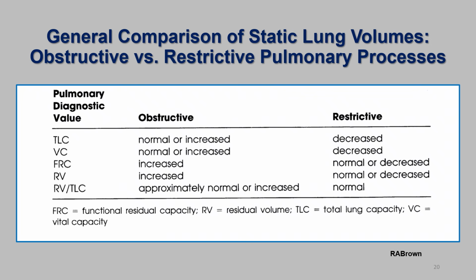They are also used to determine the best course of treatment as well as the effects of therapeutic intervention through follow-up measurements. For example, static lung volume measurements may be more sensitive than other pulmonary diagnostic procedures, for example, forced expiratory maneuvers, to detect the pulmonary toxic effects of some cardiac and chemotherapy agents.